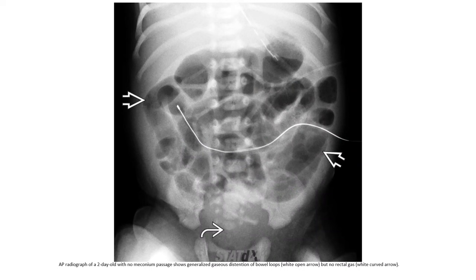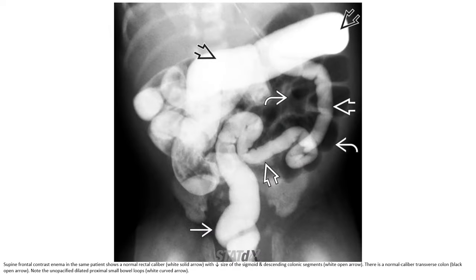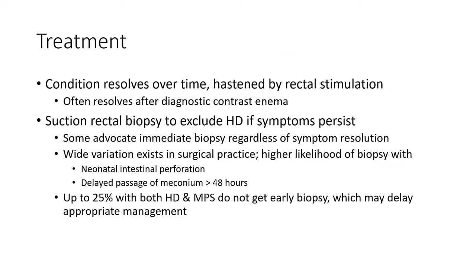AP radiographs of a two-day-old with no meconium passage show generalized gas distension but no rectal gas. Frontal contrast enema in the same patient shows a normal rectal caliber with decrease in size of sigmoid and descending colon, with normal caliber of the transverse colon. Note the retained meconium filling defects in the colon proximal to the caliber change.